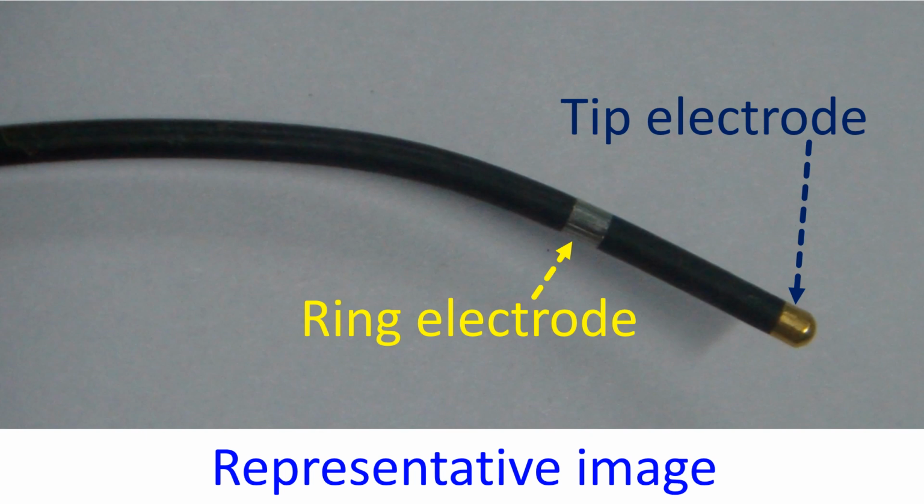They compared a short tip ring distance of 1.5 mm with a conventional electrode with a larger tip ring distance of 10 mm. 36 patients with indication for DDD pacing were implanted with short tip ring distance electrode, while 23 patients were given conventional electrode. FFRW and P-wave amplitudes sensed were measured during pacing and intrinsic rhythm at the time of implant. Repeat measurements were obtained at discharge and at follow-up between 10 to 14 days after implantation.